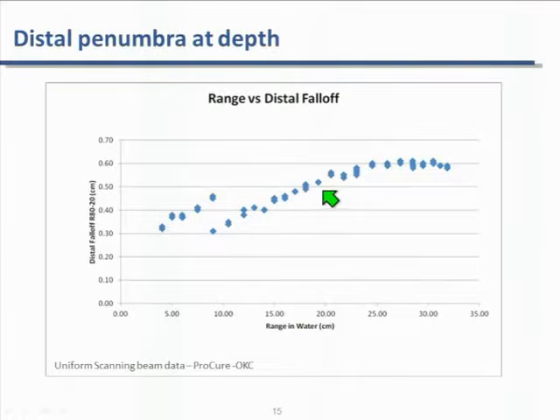If you think of a point at depth where the proton is going to stop at the very end of the delivery, you can imagine as the path increases in length, there are more pathways for the protons to get to that point. So the protons stop at the distal end with a slight energy spread, and that's what we call energy straggling.